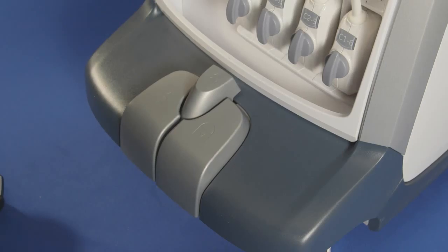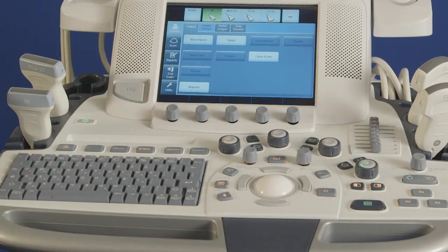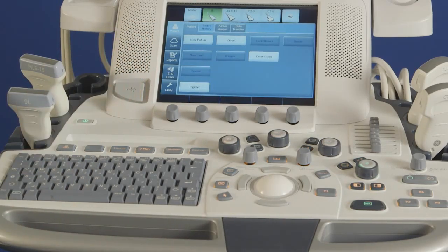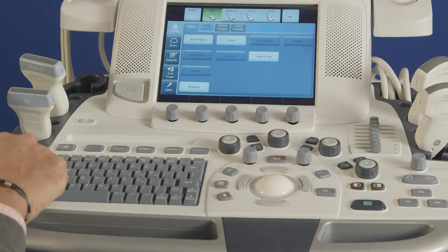Probe ports are located on the front base of the console. To plug in a probe on the Expert Series, hold the probe connector in hand with the gray latch turned horizontal, insert the probe into the active probe port, and turn the gray latch vertical to lock in place.